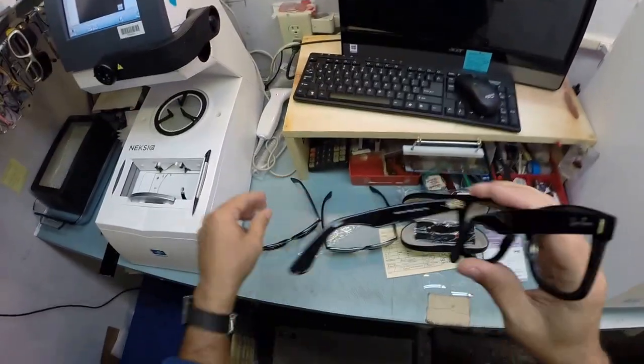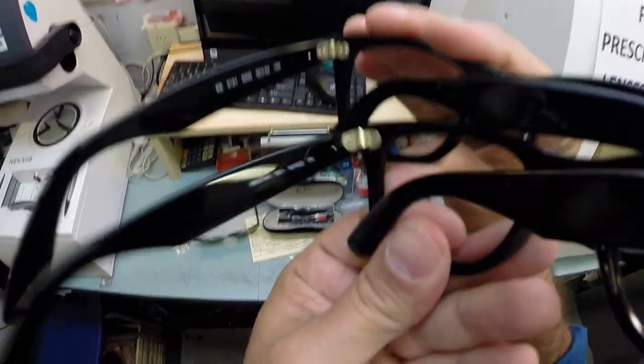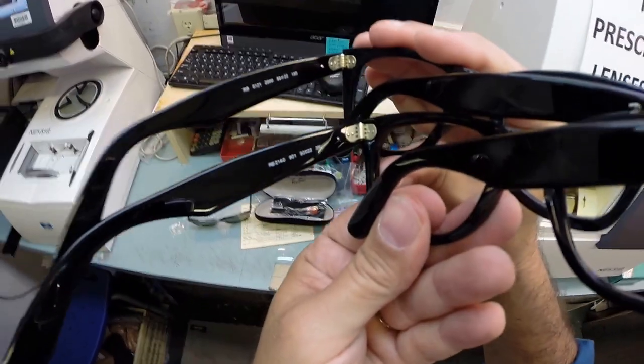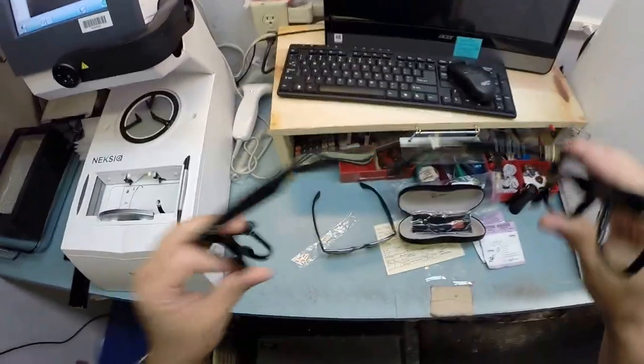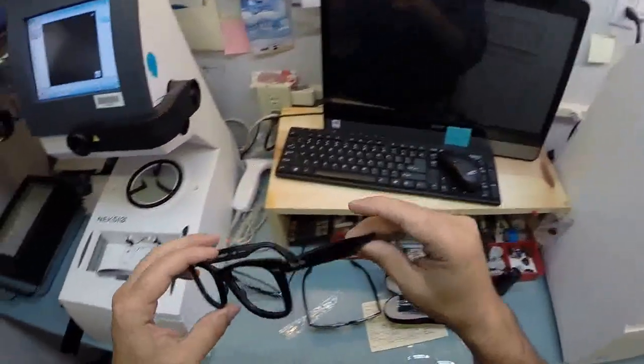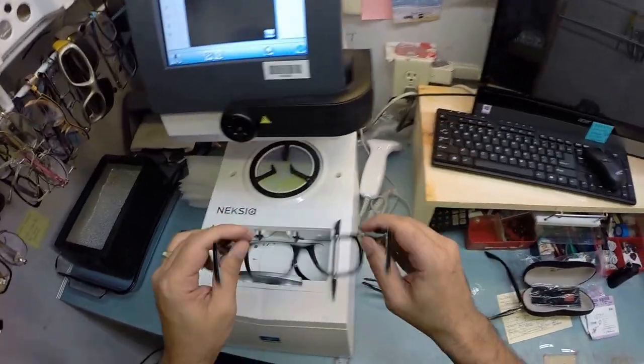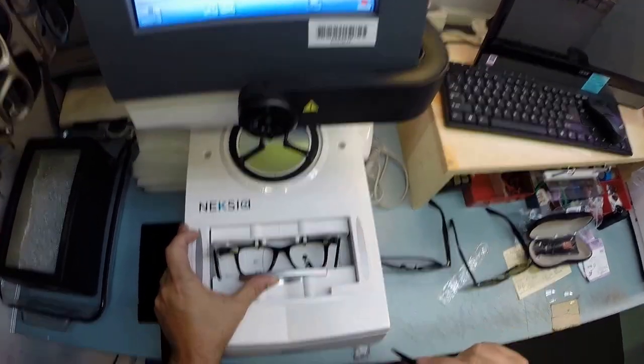They both still have the triple barrel hinge. None of that has changed. Still made incredibly strong. You can run over these with a car. Although, I don't recommend you doing it. And, let me make sure I got the right one. Yep, 5121. Other than that, they are identical. In fact, I bet the lenses will even pop into these. But, I'm going to take your frame, put it into the tracing element of my edger, and hit start.